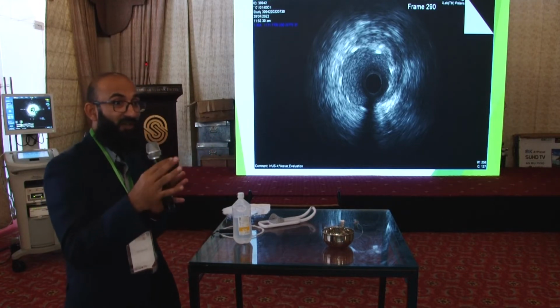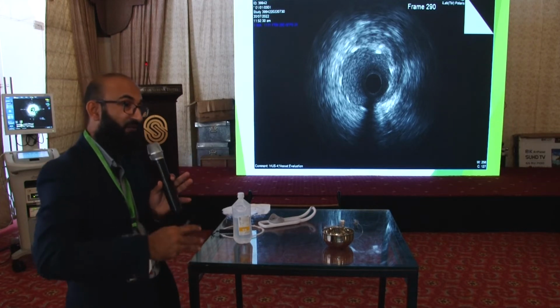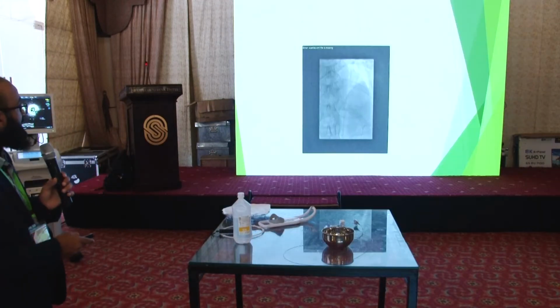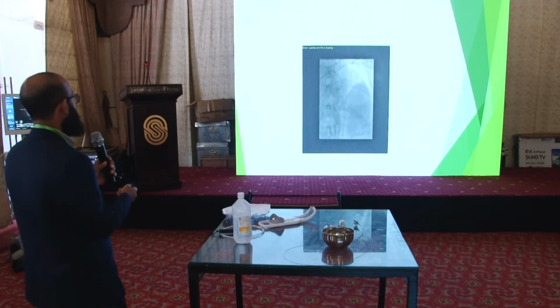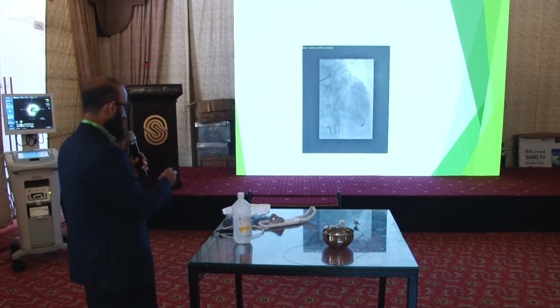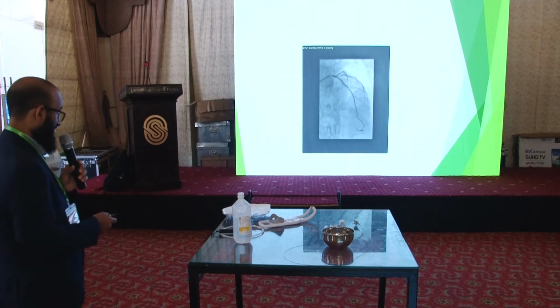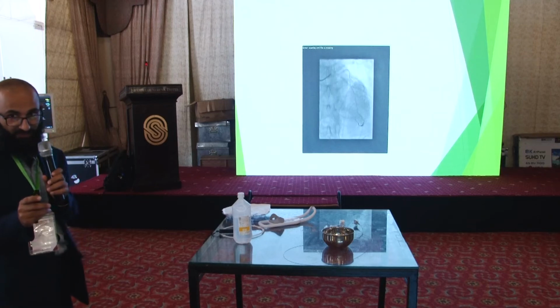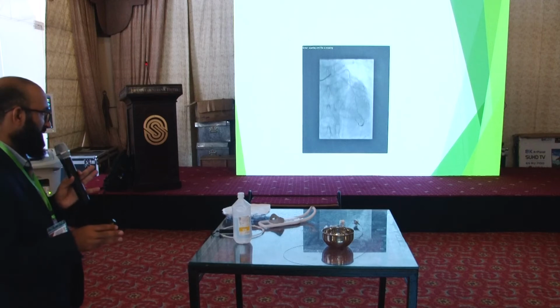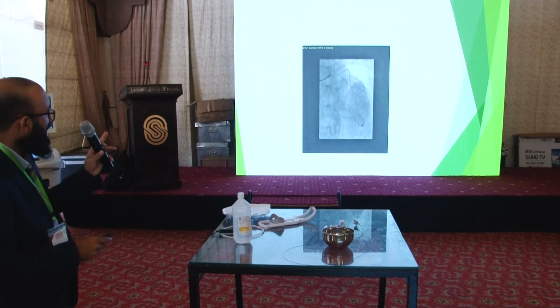So you need to do cutting balloon or rotablation, that's important. And you have to upgrade the burr size according to your vessel. Next, please. Can we play this? So this was the post dilatation with a 3.75. And we didn't want to disrupt everything, because this was an acute STEMI, and that's why we were not going that aggressive. So we had a good angiographic result.